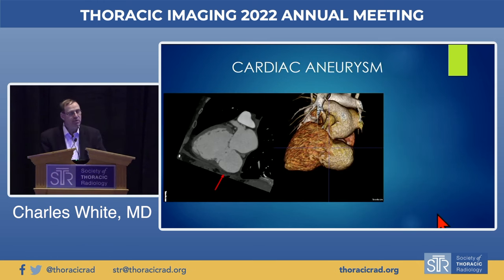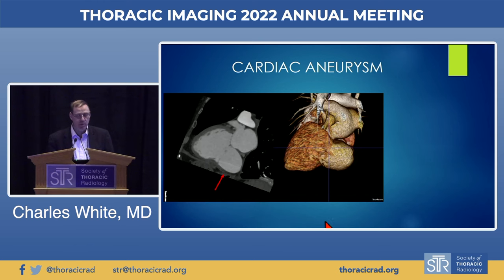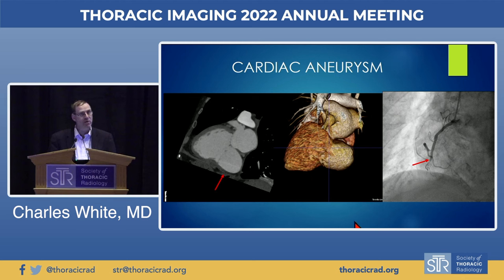Cardiac CT can also show left ventricular aneurysms — outpouchings of the left ventricle — which can be demonstrated in motion and volumetric reconstruction, along with catheterization showing RCA occlusion as the etiology. We can separate left ventricular aneurysm from pseudoaneurysm; the best distinguishing feature is the size of the mouth. A wide mouth suggests a true left ventricular aneurysm.